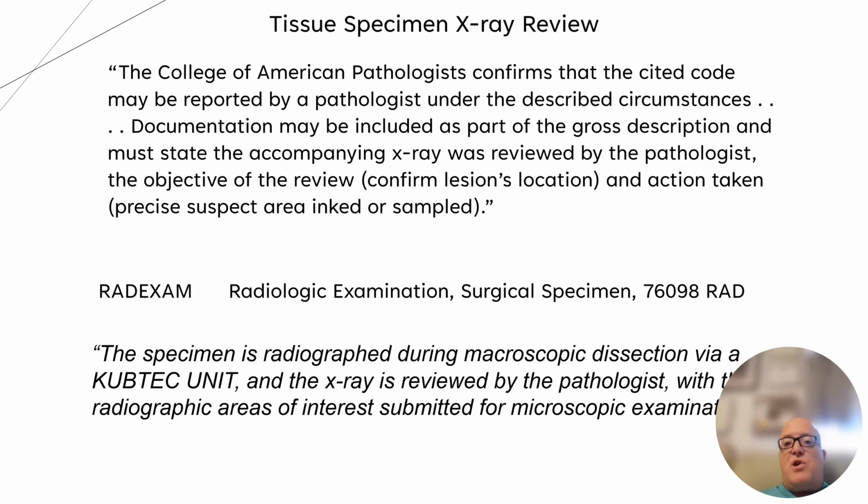It's a separate entity and a completely separate charge from what the surgeon does when they take a radiographic image of the lumpectomy or mastectomy and put it into PACS. So just understand there's two separate images, one that the surgeon provides, one that we provide. It goes into our LIS system for the pathologist to look at, which has an associated charge, and you can certainly do that. And that's what we do.